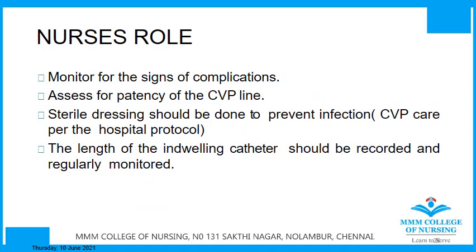Let's see what is the nurse's role. First thing, monitor for the signs of infections and complications. Assess for the patency of the CVP line. Sterile dressing should be done to prevent infection, and especially CVP care, that is as per the protocol of the hospital. If it is 72 hours, then you will have to change the dressing every 72 hours.